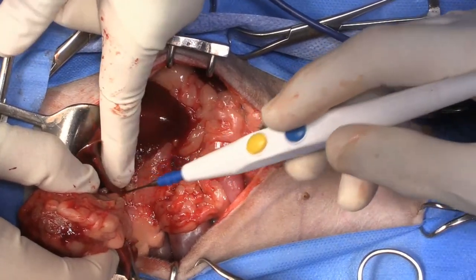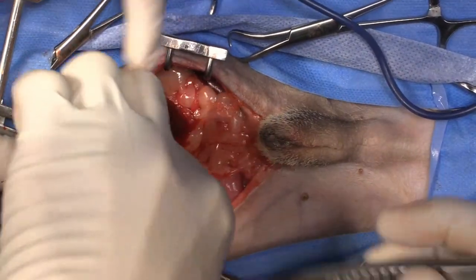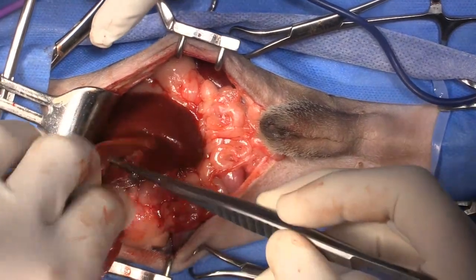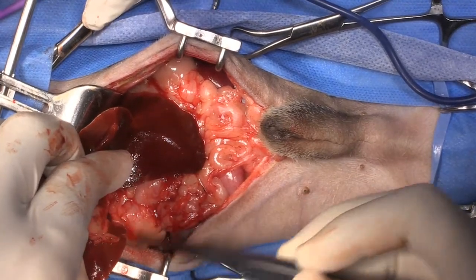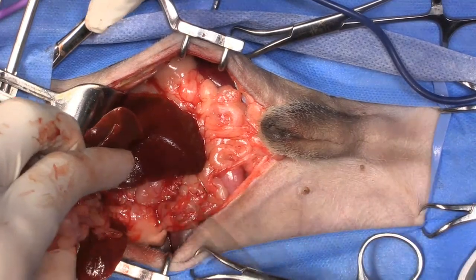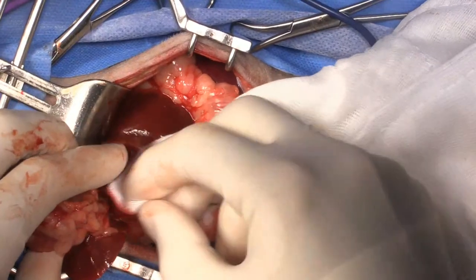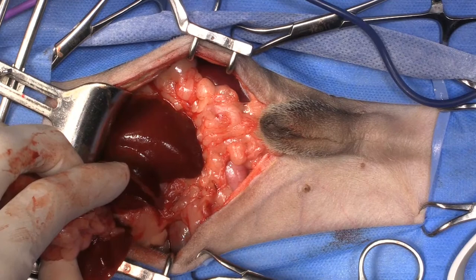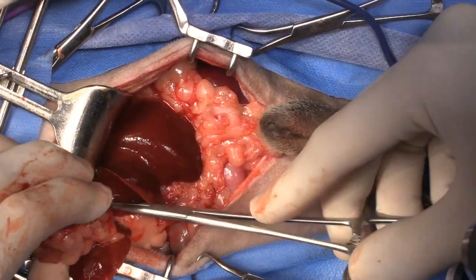So that's a hepatic duct from another lobe. Brother from another mother. Yeah. So I'm pretty sure that's the bile duct right there. And we have checked blood work this morning, and we know that the dog is not jaundiced, so the bilirubin's normal.